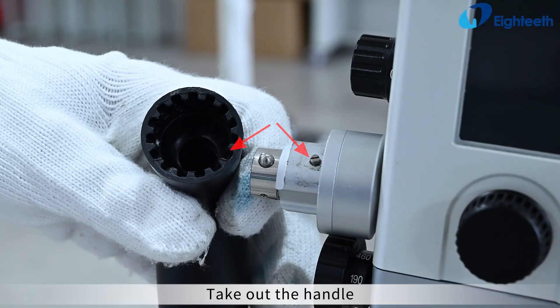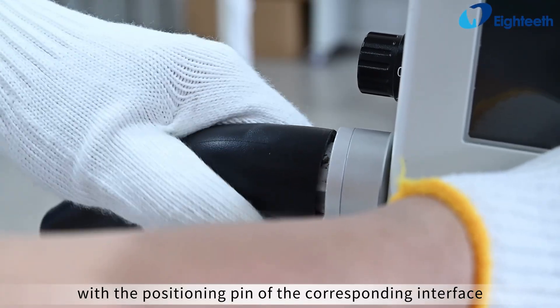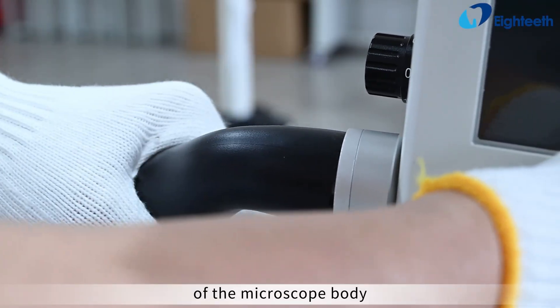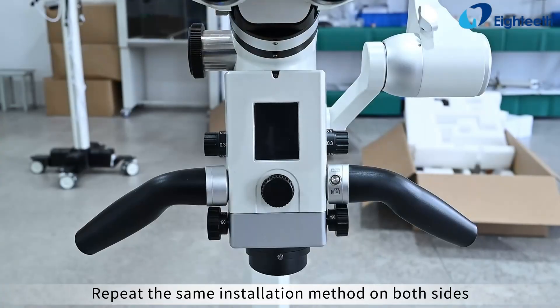Take out the handle, choose an appropriate angle, align the internal groove of the handle with the positioning pin of the corresponding interface of the microscope body, and press it in firmly. Repeat the same installation method on both sides.